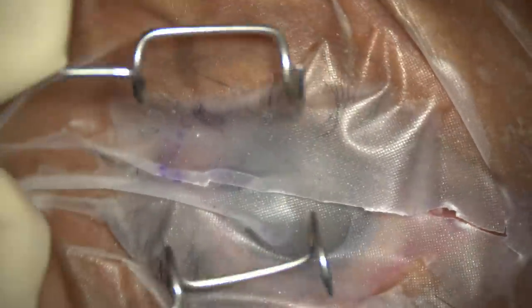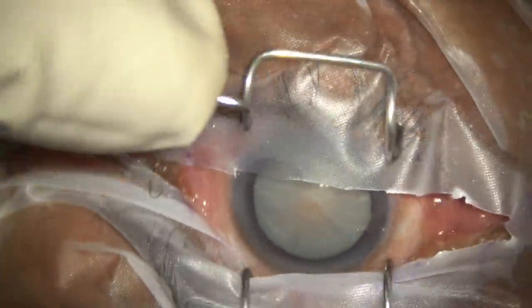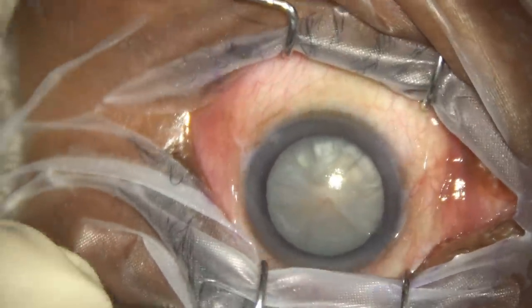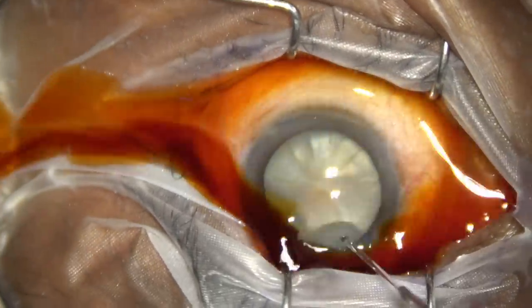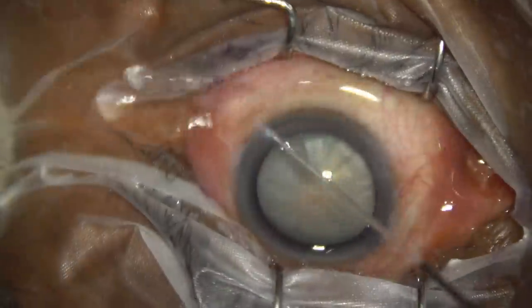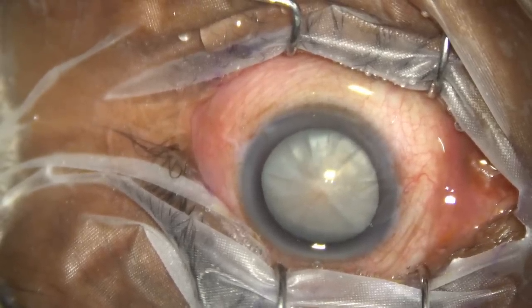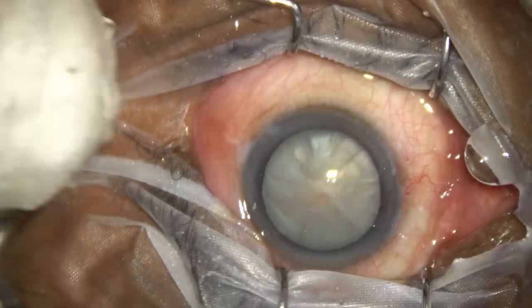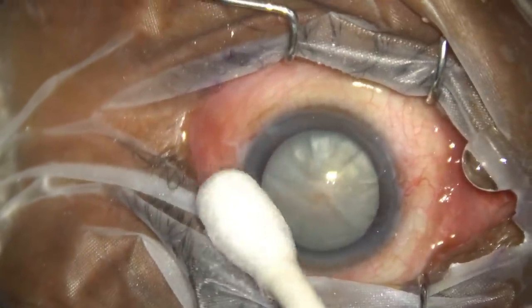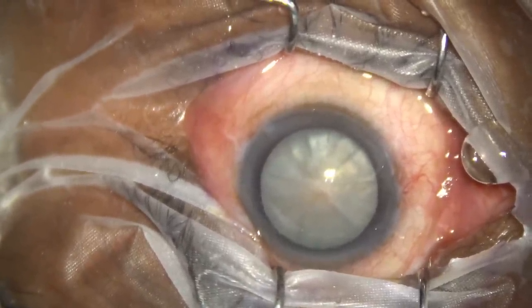This plastic drape should be placed in such a way that the eyelashes are nicely covered. Now this is ocular surface irrigation with BSS. The eyeball is tilted upward. Sometimes it happens with periorbital block.